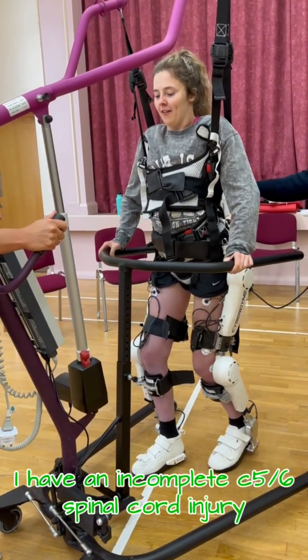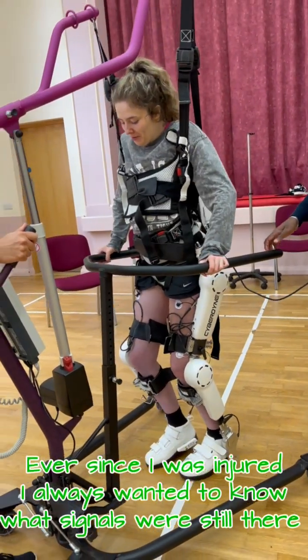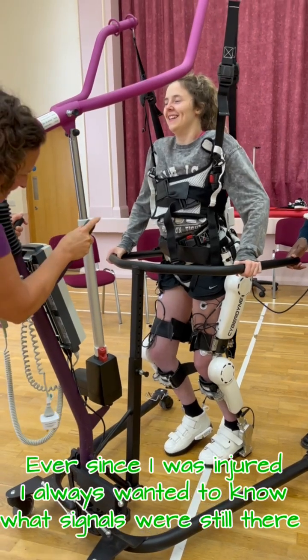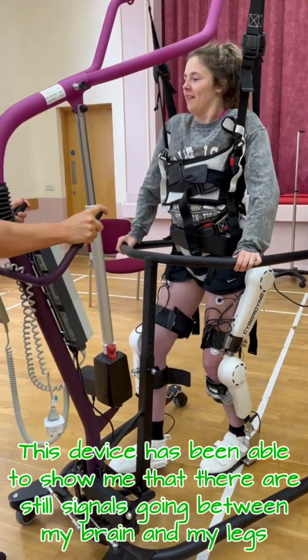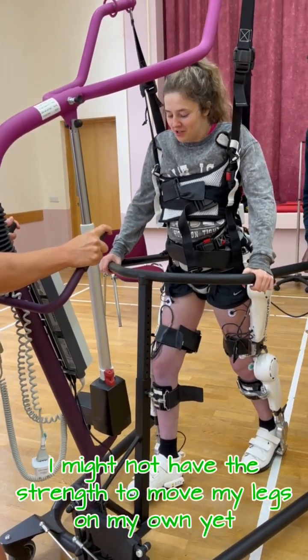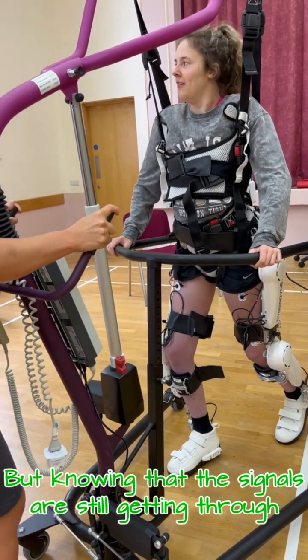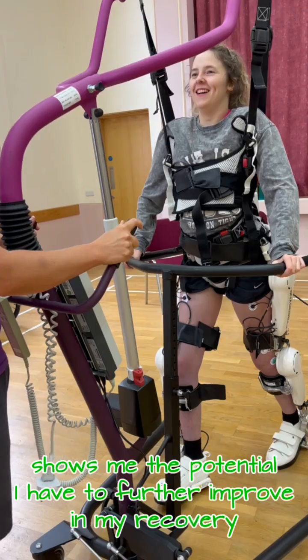I have an incomplete C5-6 spinal cord injury. Ever since I was injured, I always wanted to know what signals were still there. This device has been able to show me that there are still signals going between my brain and my legs. I might not have the strength to move my legs on my own yet, but knowing that the signals are still getting through shows me the potential I have to further improve in my recovery.